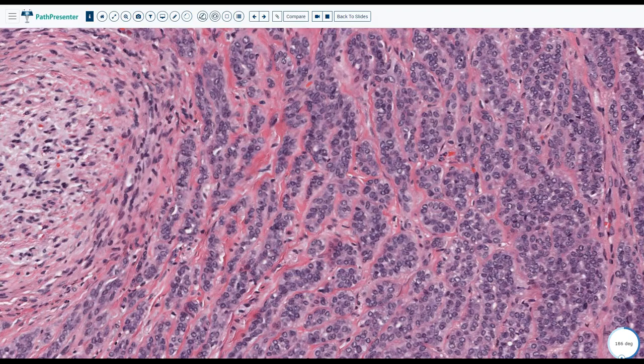Again, you can do the immunostains for that. MIB1 to exclude it. It's not much hyaline material or matrix to start with, but solid areas of adenoid cystic carcinoma and basal cell adenoma or adenocarcinoma are also possible. So sometimes we just say low grade, and if you don't have much, you can use basaloid. I don't like to use that if it is more obvious, but you can use it if it is kind of not secreting that much, and recommend the full excision for that.